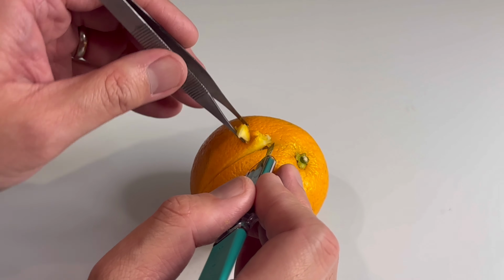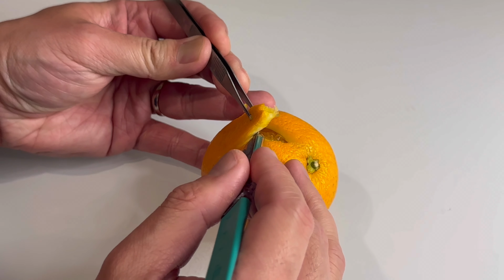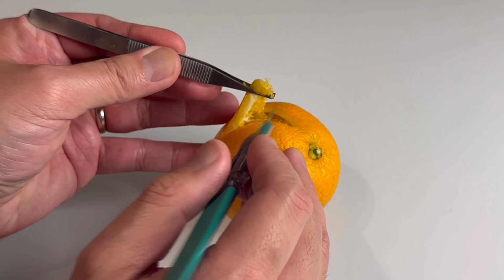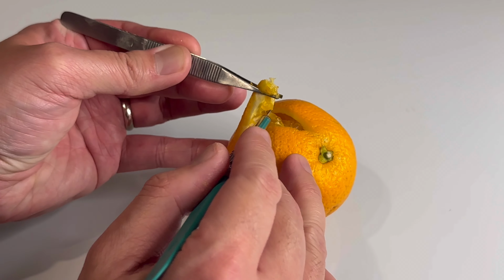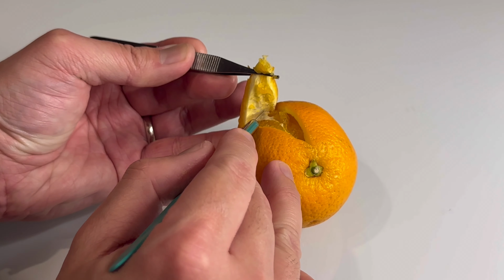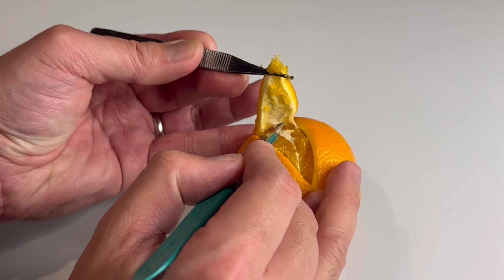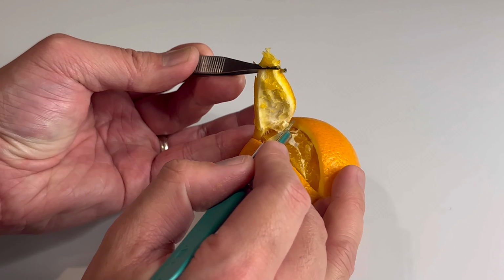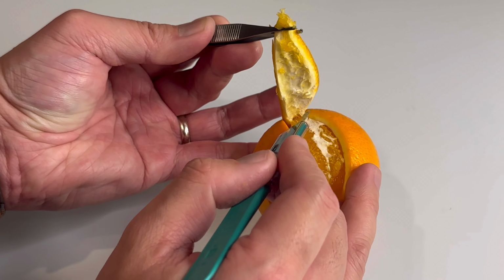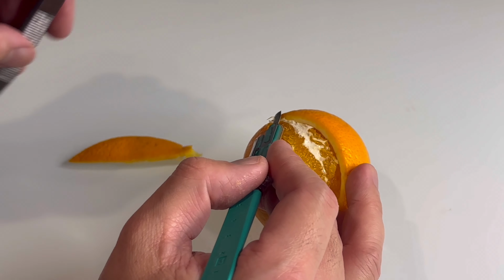Right there. And then you can peel the orange downward as you go. And so as we retract further, you could see the planes are separating, and then you can cut it and then leave the orange with the peel above. And so by doing this as a practice, you can understand planes using sharp dissection.